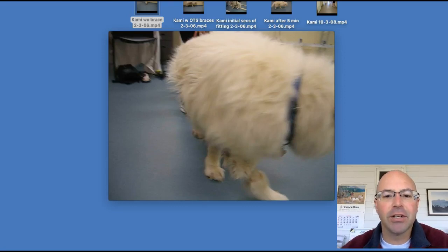Hi, everyone. I'm Ben, the orthotist here at Hero Braces. I'm excited today to give you a little case presentation on a hawk brace here.